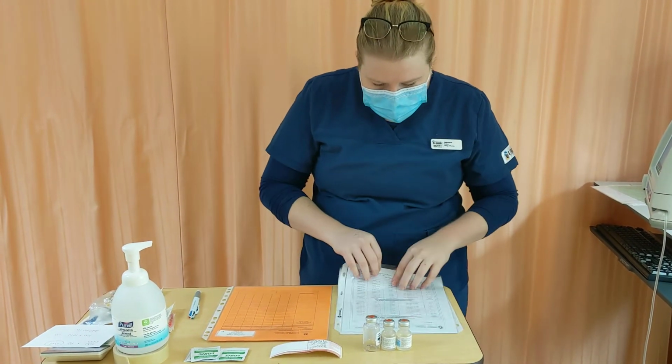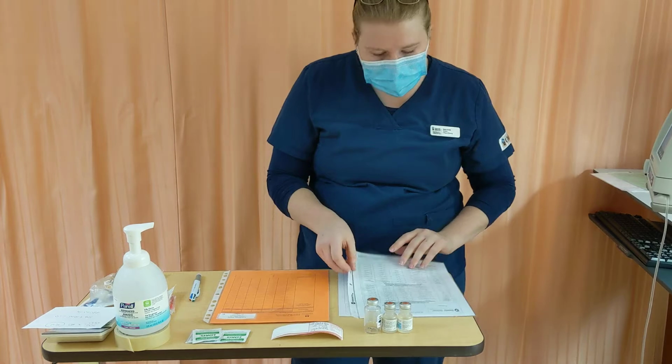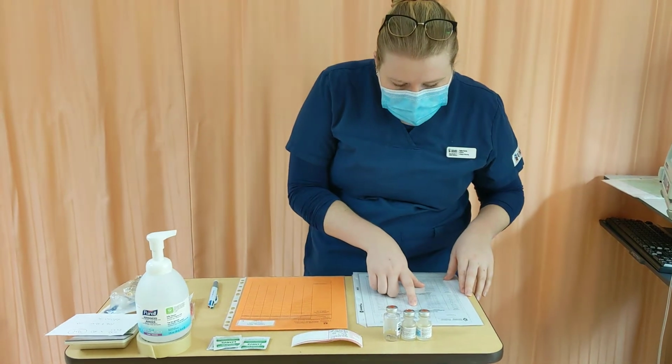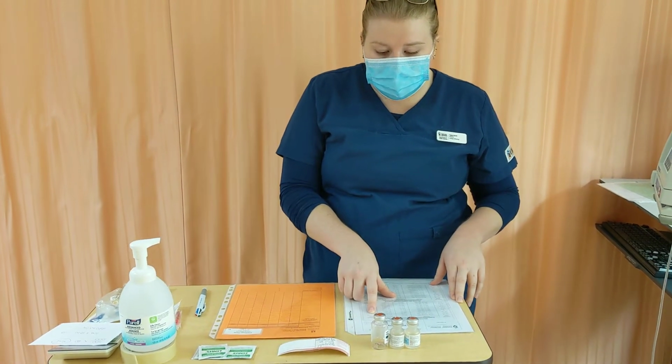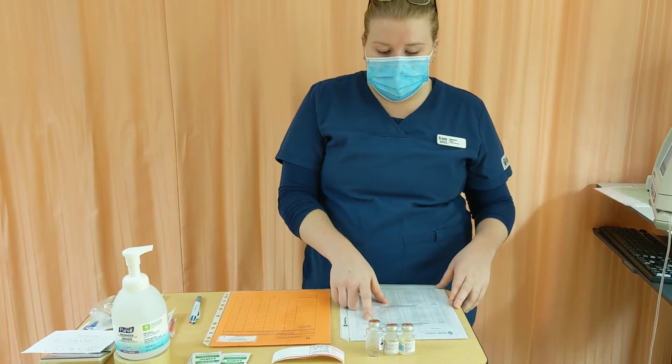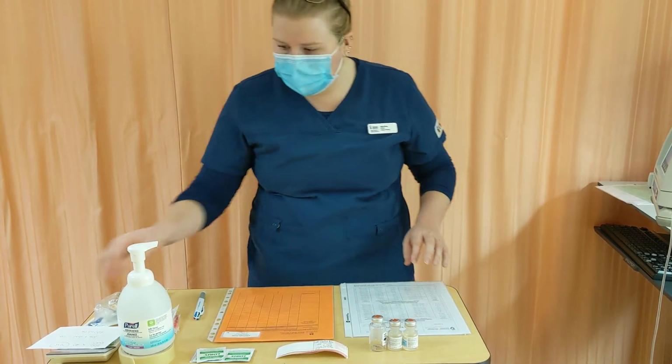I'm just going to make sure it's not expired, and it's not, so that's perfect. Normal saline is compatible, as it says on the PDM, and that's what we have running at 25 cc's an hour on the primary, so that's good. So we're going to have 110 of the final volume over 30 minutes. So we're going to do 220 milliliters an hour to get the correct dose over the 30 minutes. After I've looked at all of that, I'm also going to show you my calculations so that you know that I've calculated the right dose and the right flow rate.